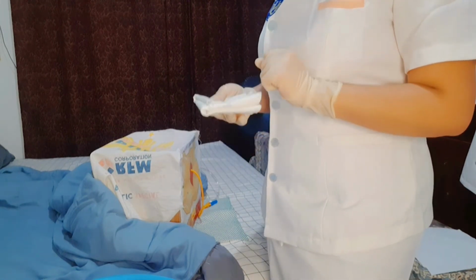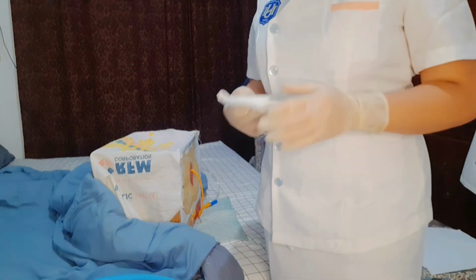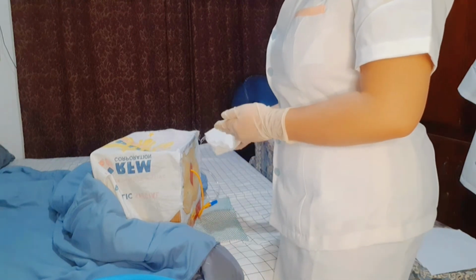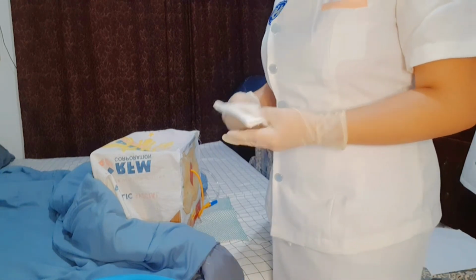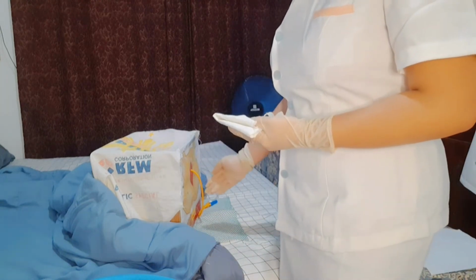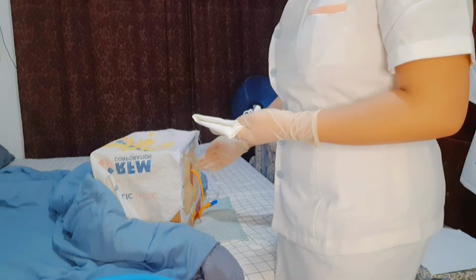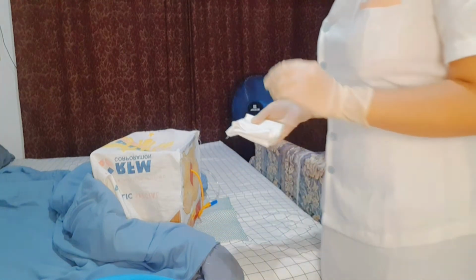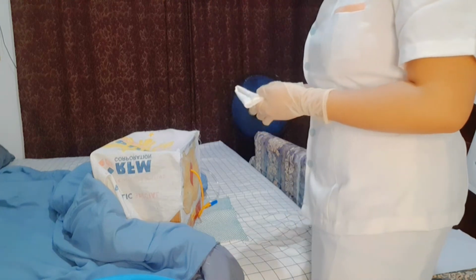So for a female client, the first thing that you need to do is to separate the labia and cleanse from front to back, beginning in the center, then clean each side. So, with every section of the cloth, you need to clean each side. With every stroke, you clean every side of the labia of the female client. And if there is drainage, use a non-irritating antiseptic solution on a cotton ball or even a cotton swab.